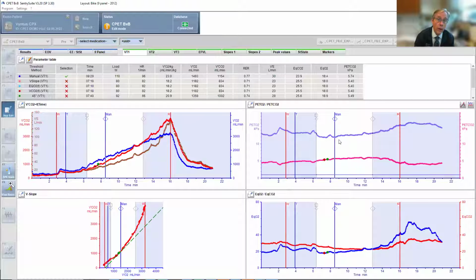So you're going to use the software to actually verify what's going on, and it allows you to check what your technician and the computer will actually have picked. I challenge you not to just agree with what it comes up with, but actually look at the graphs and make sure they make sense in terms of reassessing the V slope, reassessing the gas exchange ramifications of that V slope. So the other one would be the actual slopes themselves.